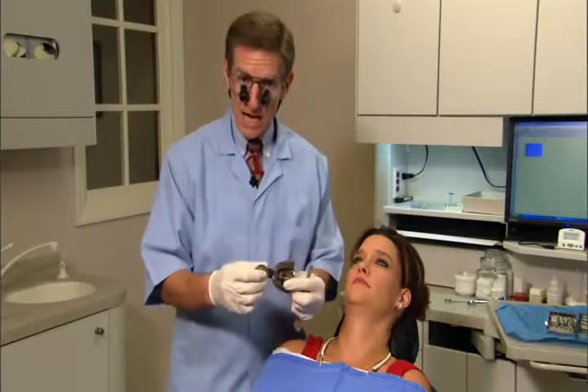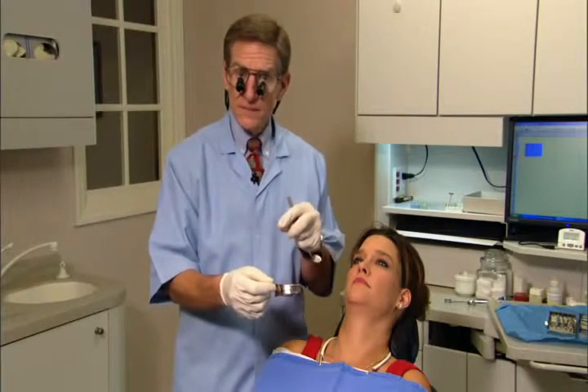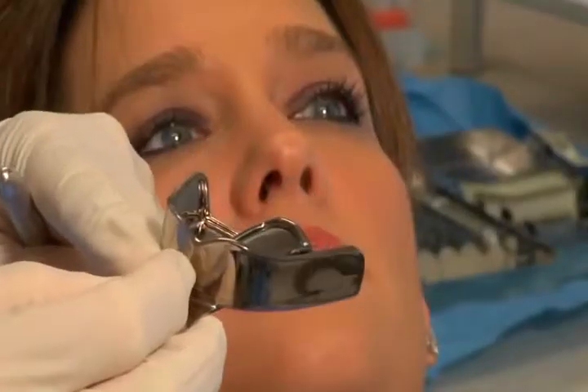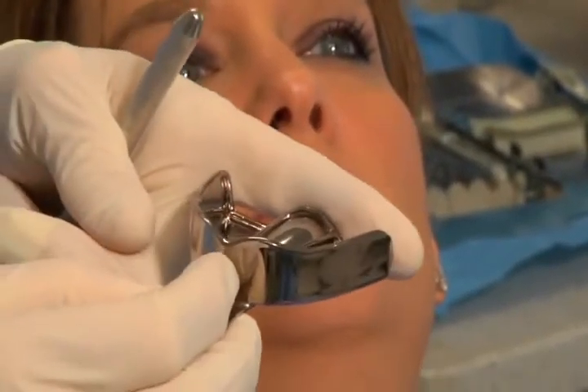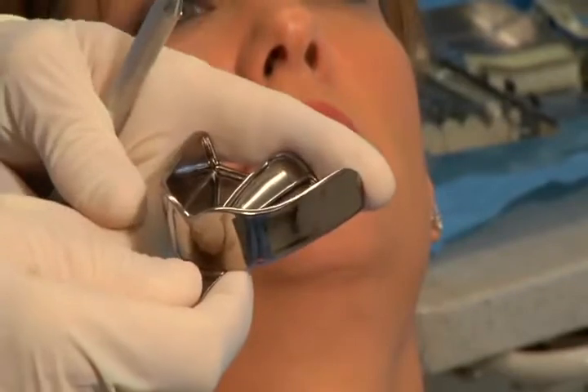With a perforated tray, all the excess comes out of the bottom, so you don't get a nice impression of the fornix. The rimlock also creates a little dam in the back so impression material doesn't run down the patient's throat. Now let me talk about alginate quickly.